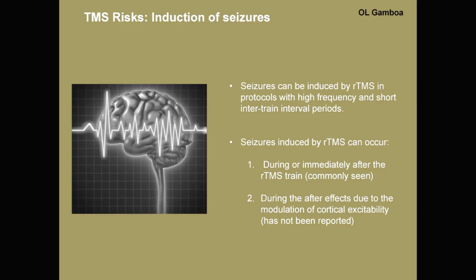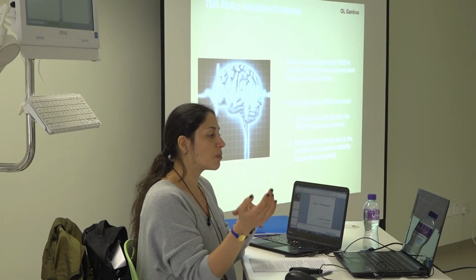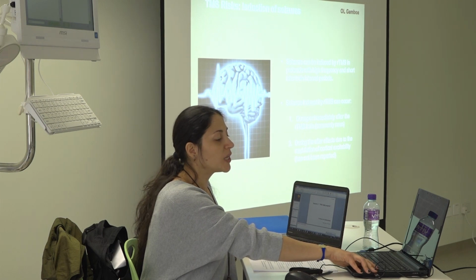Seizures can be induced by our TMS protocols in their normal, conventional form, or the patterned form. It can normally be induced after the TMS train, or immediately after, or during the train.